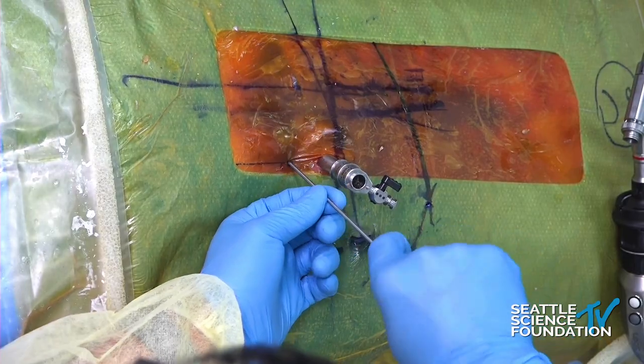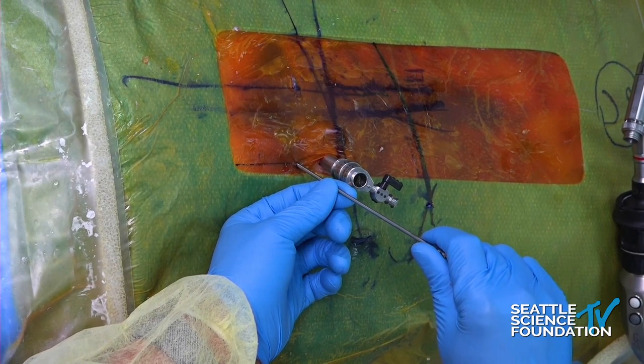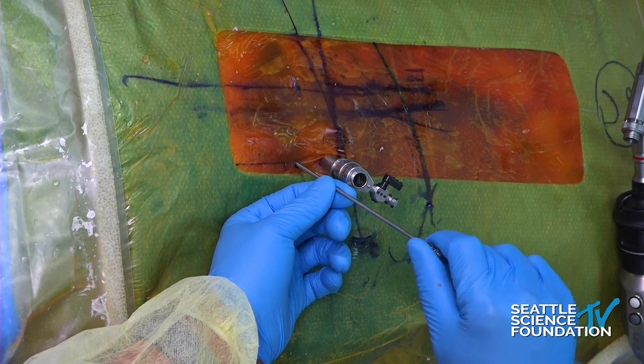So this is similar to the transforaminal approach. You want the trajectory parallel to the disk space. Take a shot there. I have no flow, no water flow. You can use gravity from here, it's better.